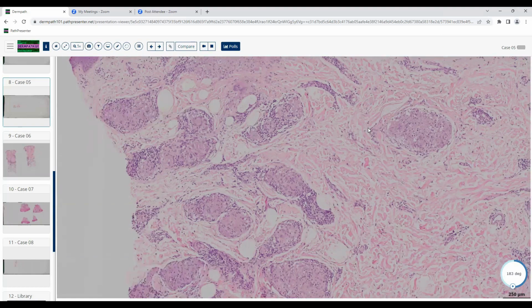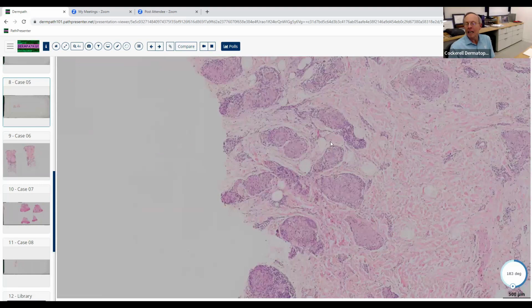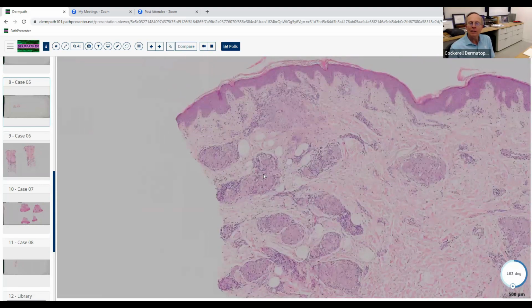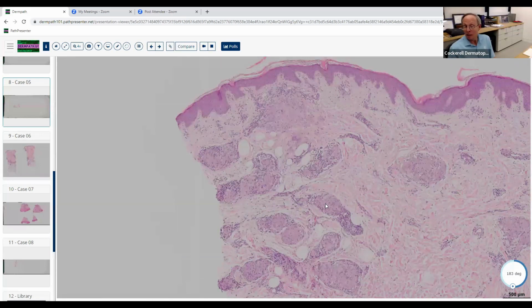It could also be like a foreign body reaction. Very good. I would choose that next. So which foreign bodies give you a sarcoidal granulomatous inflammatory infiltrate that can simulate sarcoid quite closely? Silica. Yes, silica, glass can do it. And not silicone usually. Silicone will give you more of a diffuse infiltrate with histiocytes, multinucleated foreign body cells, and the little tiny bubbles inside the histiocytes. So it doesn't really give you a sarcoidal pattern very frequently, and it wouldn't be our best choice here.